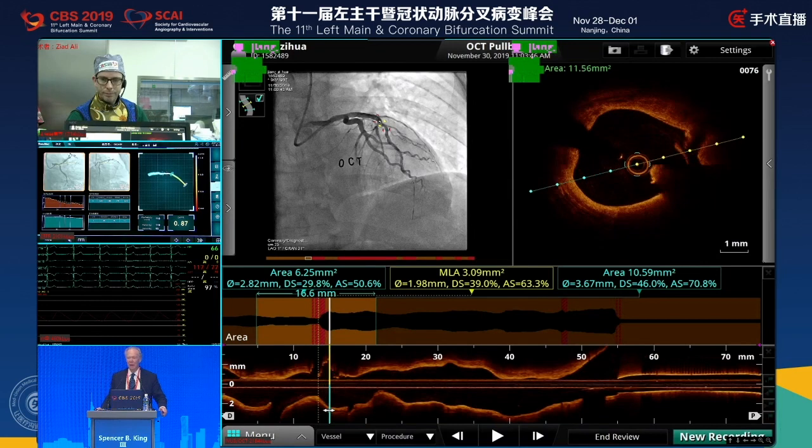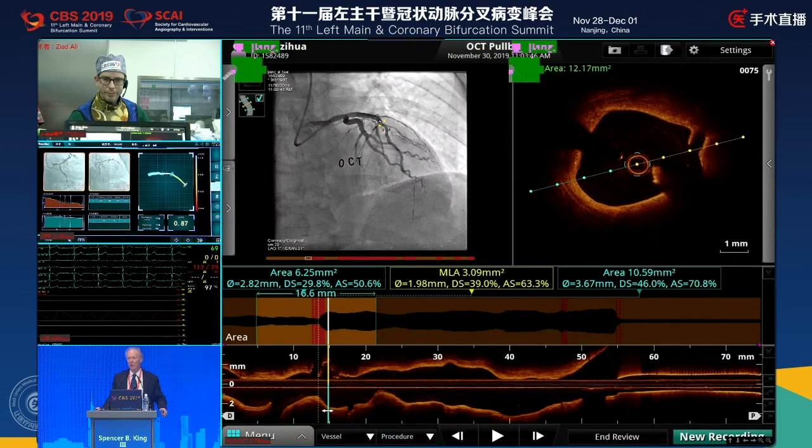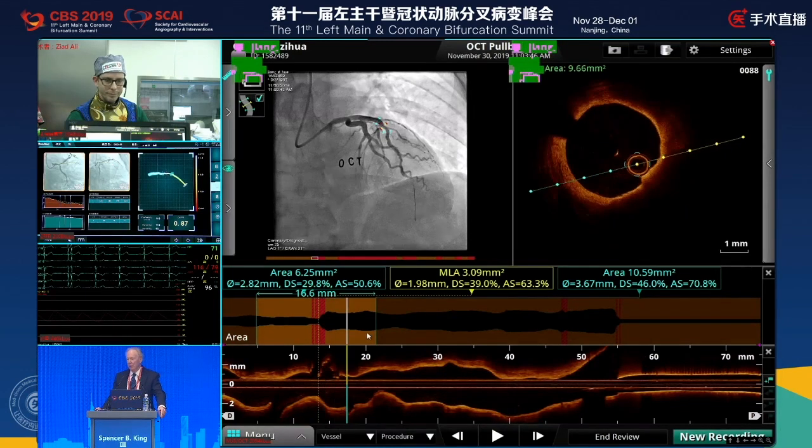We've got a non-obstructive artery. We have maybe an acute syndrome. It'd be nice to know if there was enzymatic change. And we have a little roughed up artery. And what do we do about that?